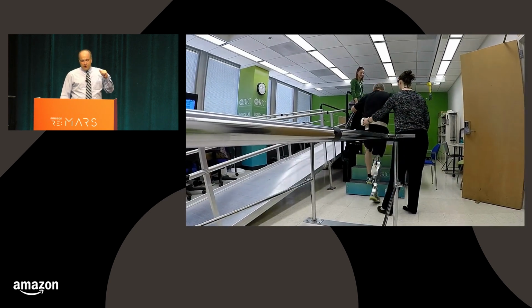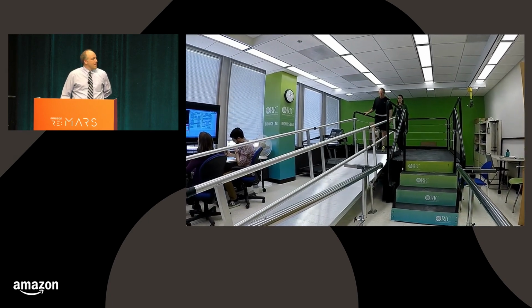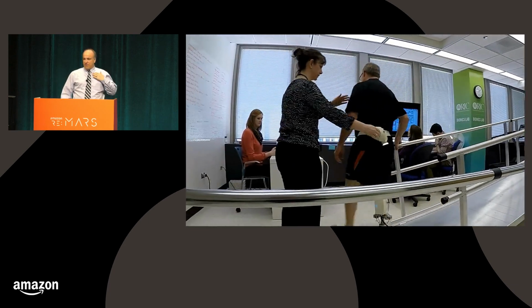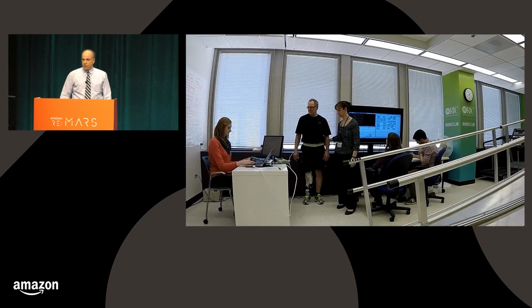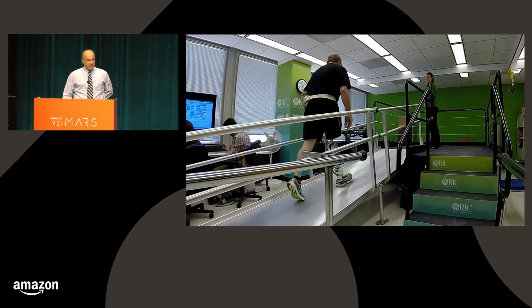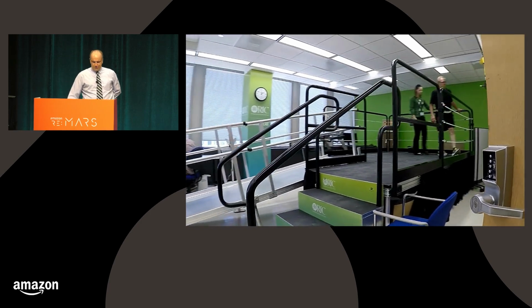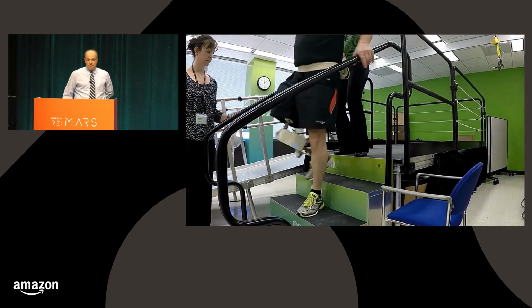And so we don't simply do straight line. We do cuts and pivots and turns. You can tell that the AI system is in charge here because we have therapists for safety. These are highly experimental devices. The less showy it looks, the better for us because this is meant to be someone's leg. But it is a cool robot. The guy's walking around doing different activities, with local control responding in real time, processing probably 25 sensors in this example. And this is, in fact, Terry, who you'll have a chance to meet later, testing one of the earlier prototypes maybe a couple years ago. Again, transition down the step, nice and compliant.